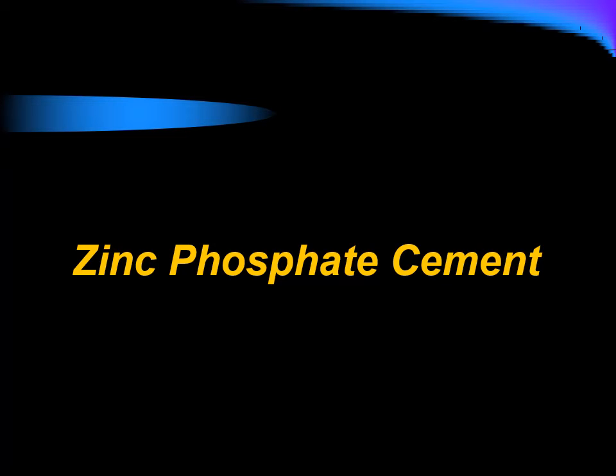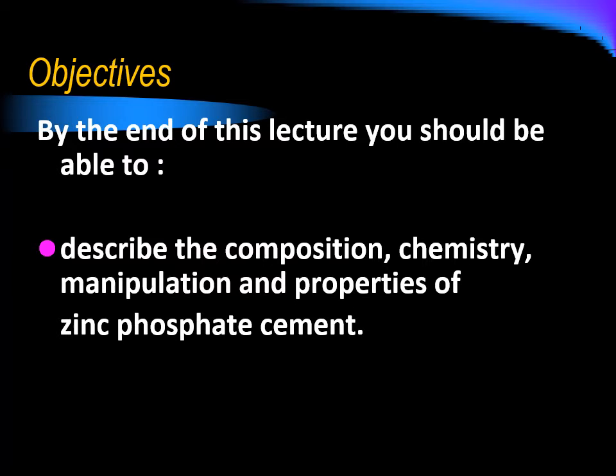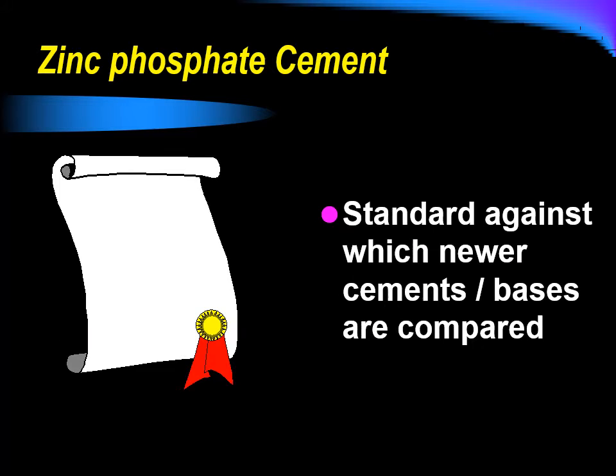In zinc phosphate cement, we have to describe the composition, chemistry, and manipulation properties. Zinc phosphate cement is the oldest type of dental cement used in dentistry, and it is still used as a standard against which newer cements are compared because of its good properties.